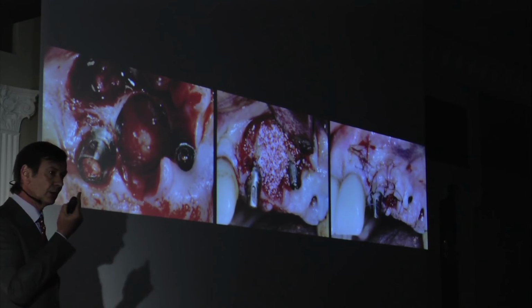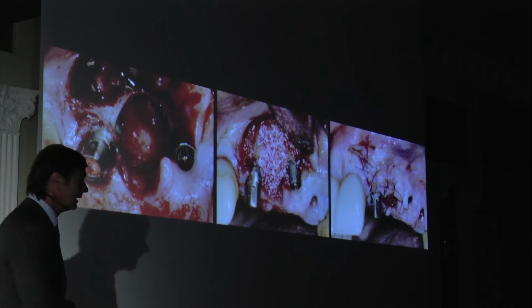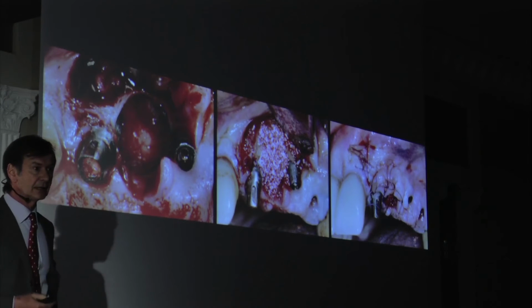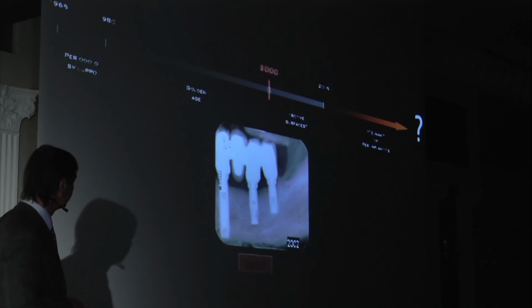If you have 1 implant, it's okay. But if you have 6 implants with this kind of defects, it's very difficult to treat them again. And you have to do it for free because you are responsible for that.